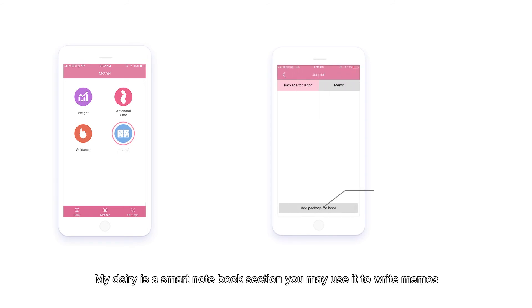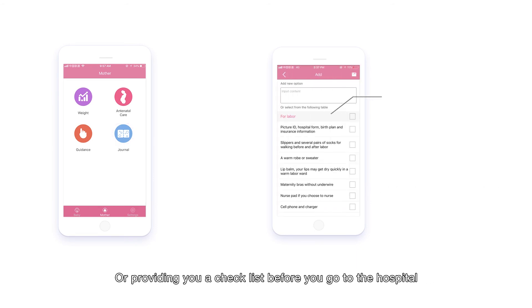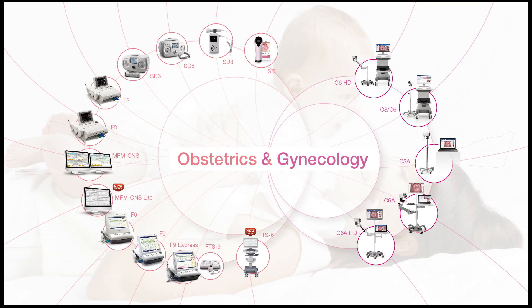My Diary is a smart notebook section. You may use it to write memos or to get a checklist before you go to the hospital. Checklists may be provided automatically or manually. Now you are all set — have fun with your little one!